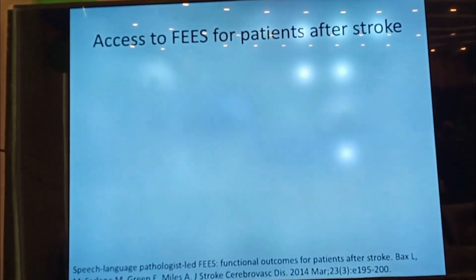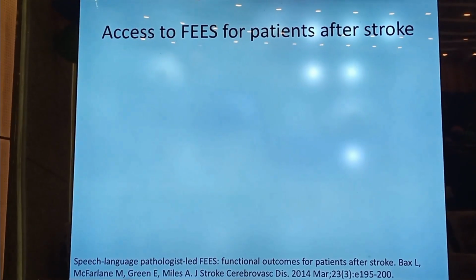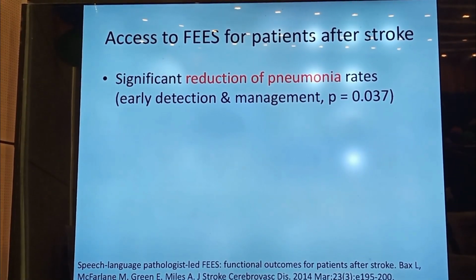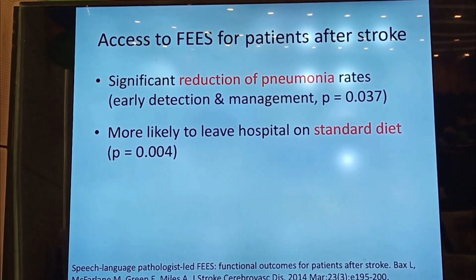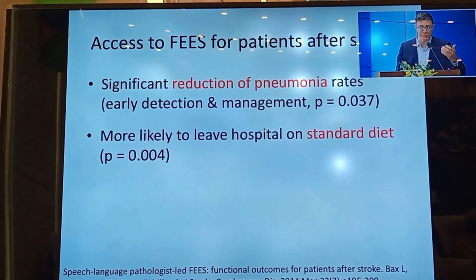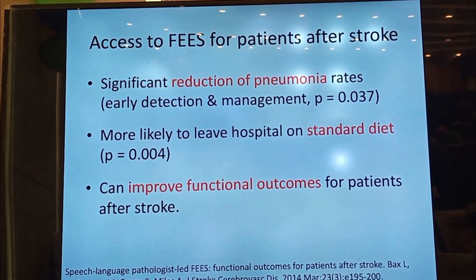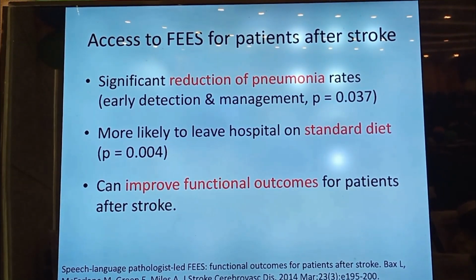There are some studies examining the benefits of FEES, for example, in patients after having had a stroke, and there is a significant reduction in pneumonia rates in patients who undergo FEES. They are more likely to leave hospital on a standard diet because there is active intervention. And performing the FEES and carrying out facilitative strategies can improve functional outcomes for patients after stroke.